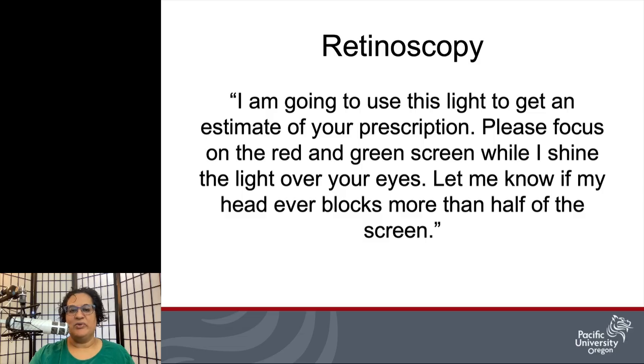During the proficiency, we will have the room illumination set fairly dim to enable you to do retinoscopy easily. Because you won't have access to the lights during your proficiency, you will have to verbalize whenever you are changing the lighting.